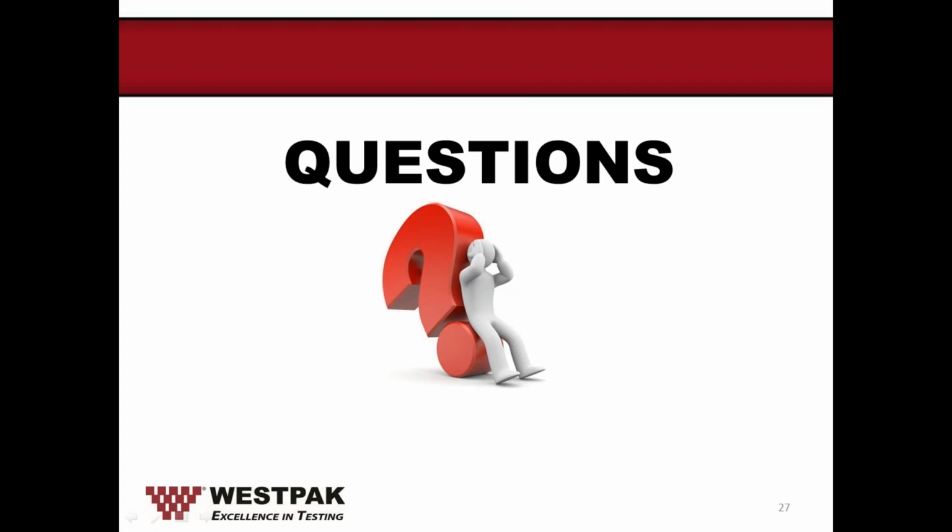ASTM D4169 is a package performance testing standard, as well as ASTM D7386. D7386 has a combination of test inputs where you will vibe with a top load. A while back, we did a webinar by Trace Wood, who compared ASTM D4169 and ISTA standards. D7386 is very similar to the ISTA 3A standard. So if you want to check out that webinar, go to our website and you'll be able to locate that.